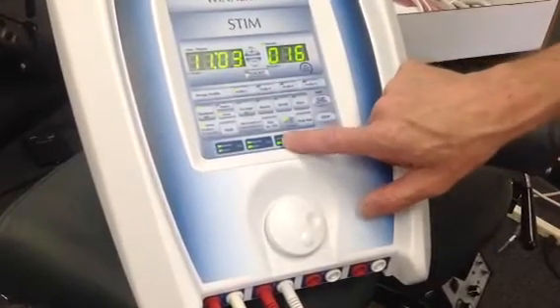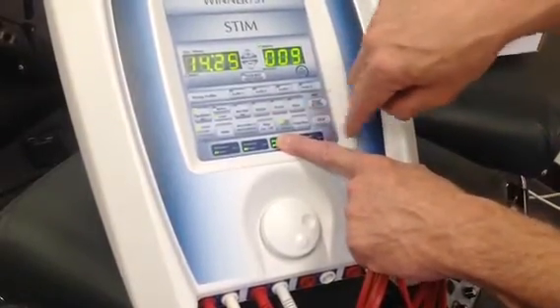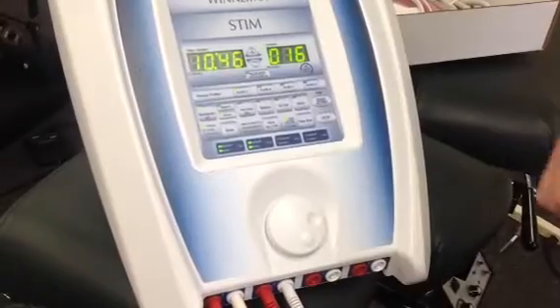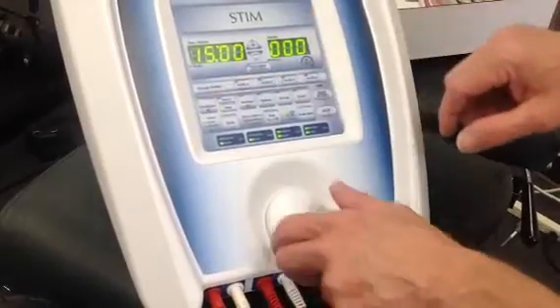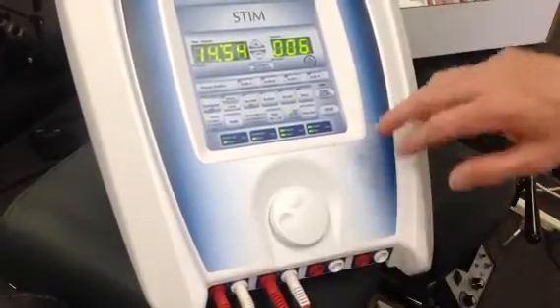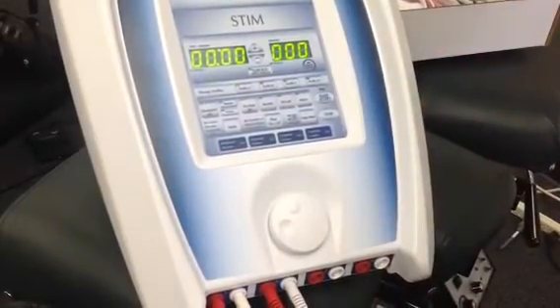And if one of the patients, let's say the second patient, patient B, you have to stop them for some reason, you hold down one of their 2 buttons, in this case it's 3 and 4, and push stop. Okay, so we stopped patient B and patient A is still going. Or if we're going to get them going again. Okay, now we're back to having both patients going again. If you just push stop, it's going to stop all 4 all at the same time. The difference being I selected somebody to stop before, and this time I just stopped everybody.